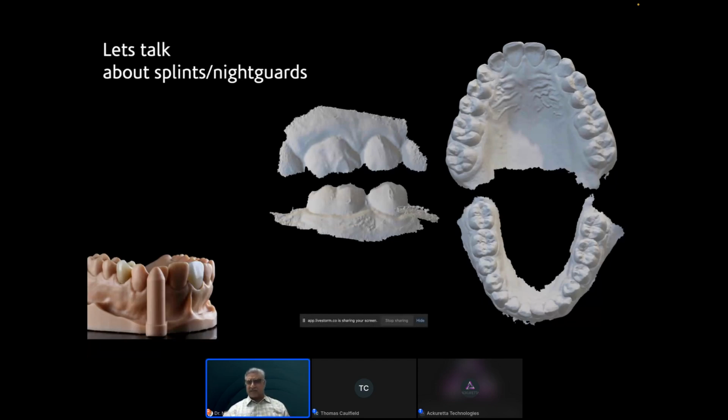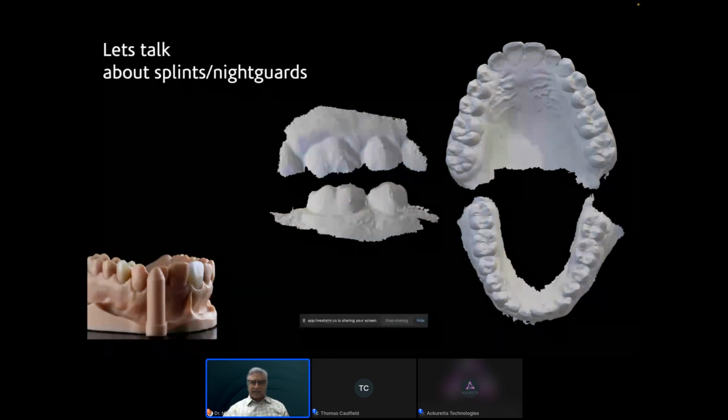I really love this with modern intraoral scanners because I used to take an impression, an upper and lower impression, and then we used to do a suck down night guard, and typically a lot of it needed occlusal adjustment in the patient's mouth when we delivered the actual appliance.